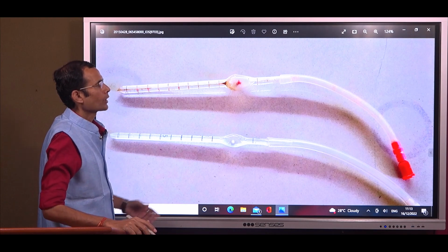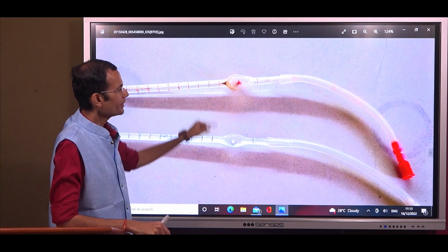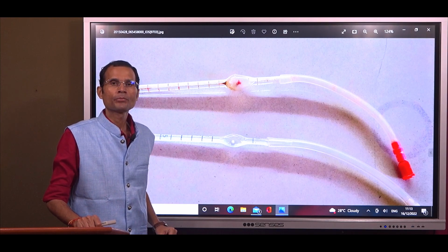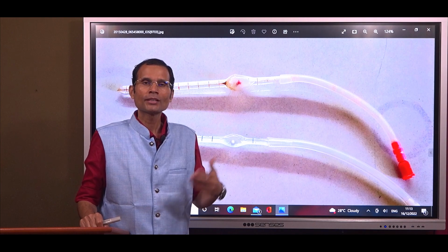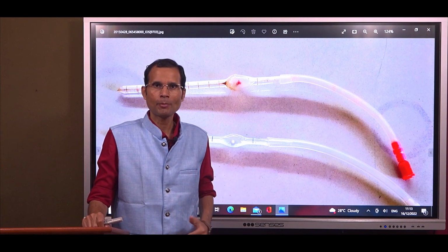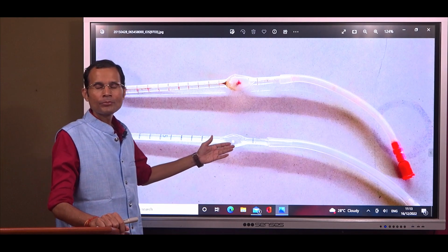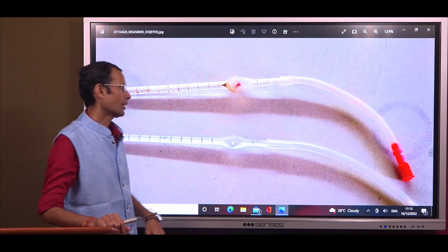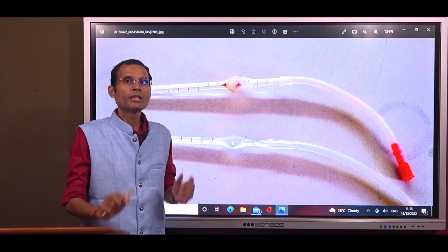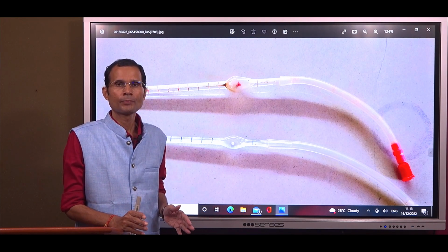All right. One more point. What is the function of the bead inside the bulb? One thing about them is that it is an identification mark: red bead for red blood cell count and white bead inside the WBC pipette for WBC count. Apart from that, the bead is actually given for mixing purposes.